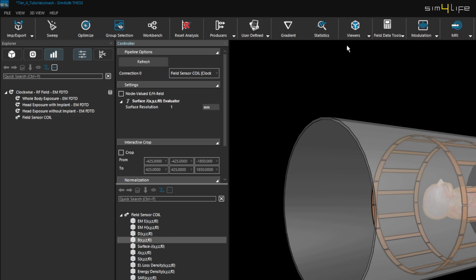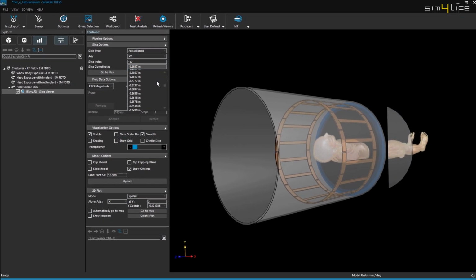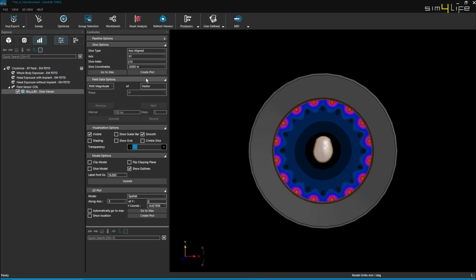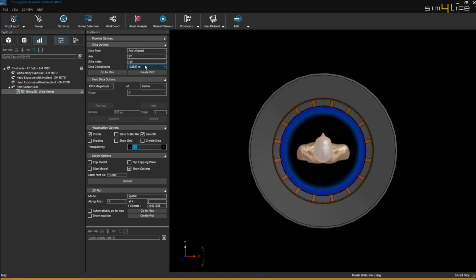From the ribbon, go to viewers and select the slice viewer. In the controller window, set the XY plane near Z equals 0, which corresponds to the isocenter plane of the coil. Examine the circular distribution of the B field to verify the accuracy of the circular polarization. Next, we will calculate the two key dosimetric quantities necessary for normalizing our results.